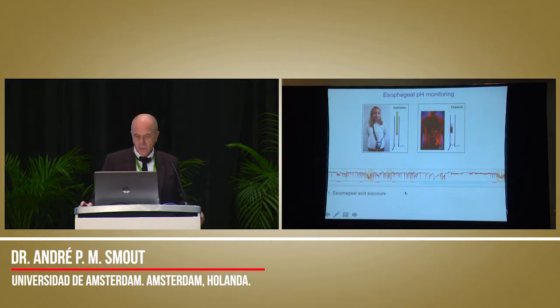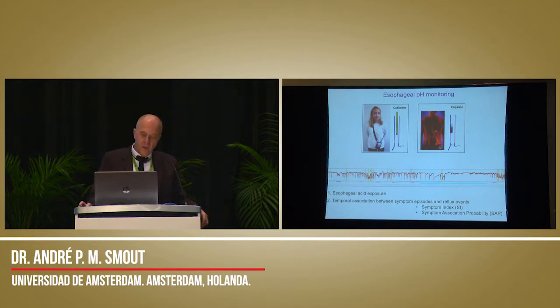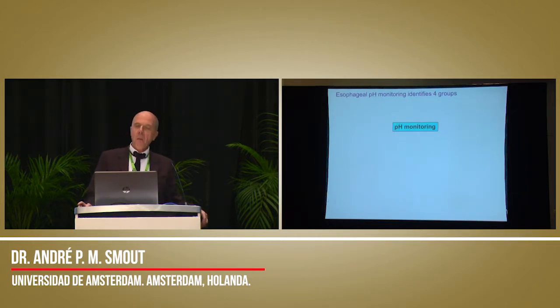But to keep life simple, I would like to stick to pH only for a while and tell you that in addition to esophageal acid exposure, a very important parameter is the temporal association between symptom episodes and reflux events, which can be expressed as the symptom index or the symptom association probability, which I learned here in Spanish-speaking countries is called PAS or PSA, I forgot.